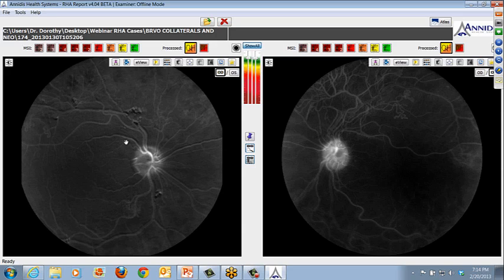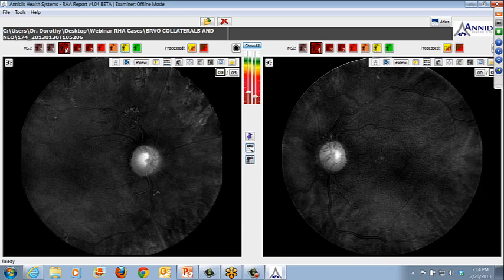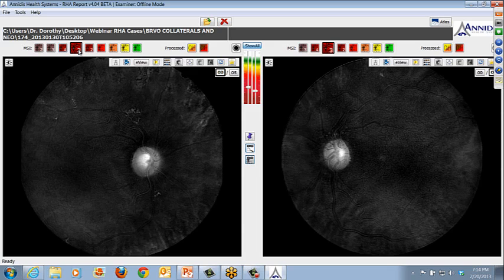So I'm not relying on this to help differentiate the vascular tissue, although having said that, I can use my own eyes here to see that there are a couple areas of concern, that the vessels are certainly more lacy, and there are a lot of collaterals. And if you move down into the reds, you can visualize the RPE, and you can see damage to the RPE here. It's highly focal and sort of not punctate, but highly regular, and so the patient has obviously had some prior laser treatment.